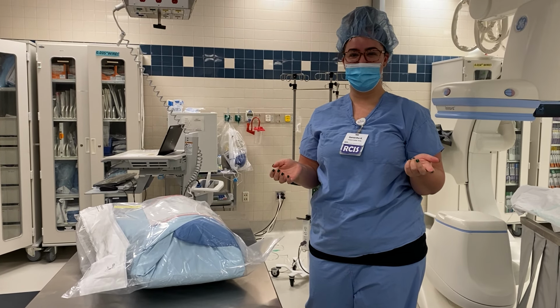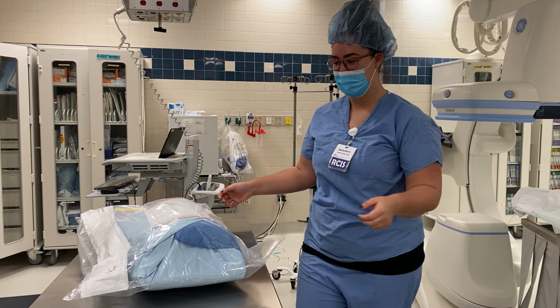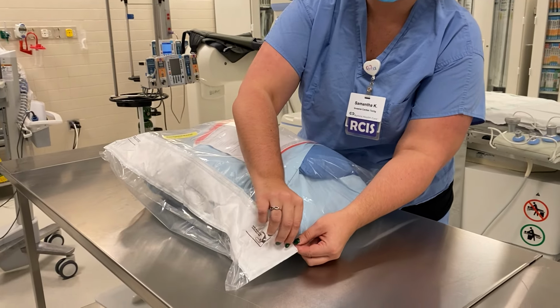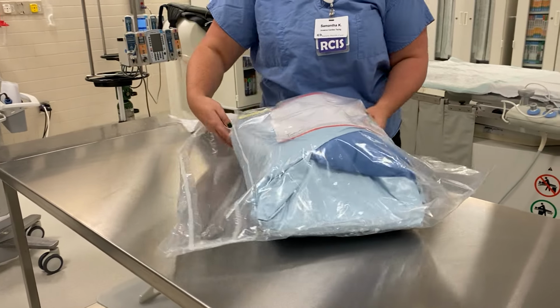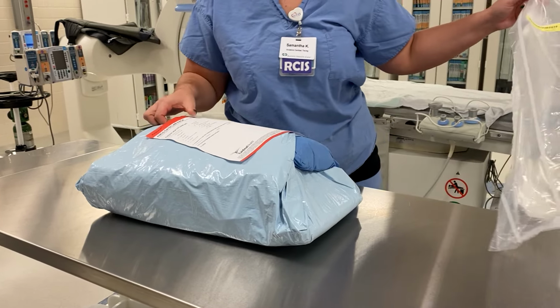Hey guys, today we're going to practice setting up a table for a diagnostic heart cath. So the first thing we're going to do is we have our pack here, and we're going to reach our thumb underneath here, and we're going to peel this piece off. And we're going to pull our cath pack out.